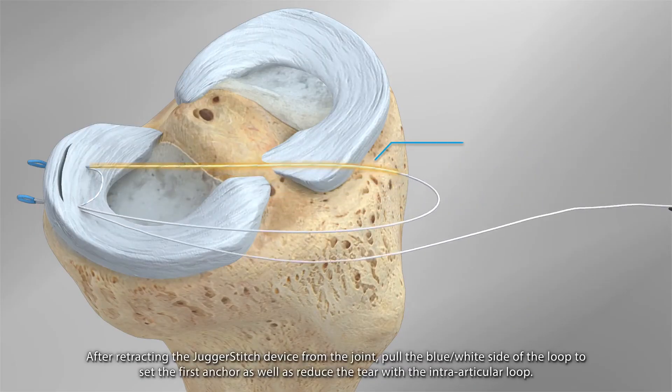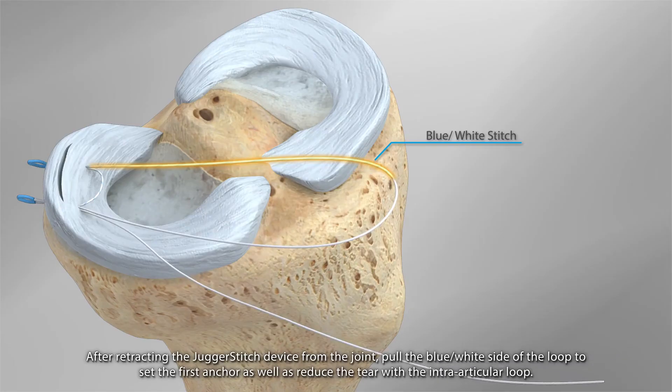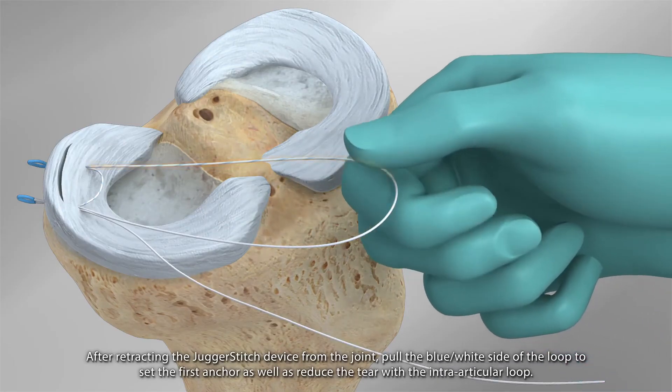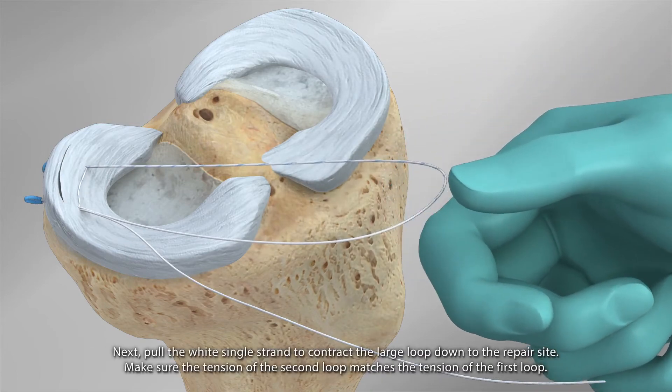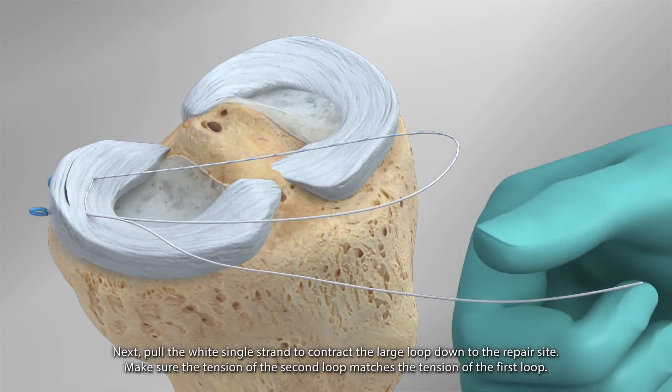After retracting the JuggerStitch device from the joint, pull the blue-white side of the loop to set the first anchor as well as reduce the tear with the intra-articular loop. Next, pull the white single strand to contract the large loop down to the repair site.